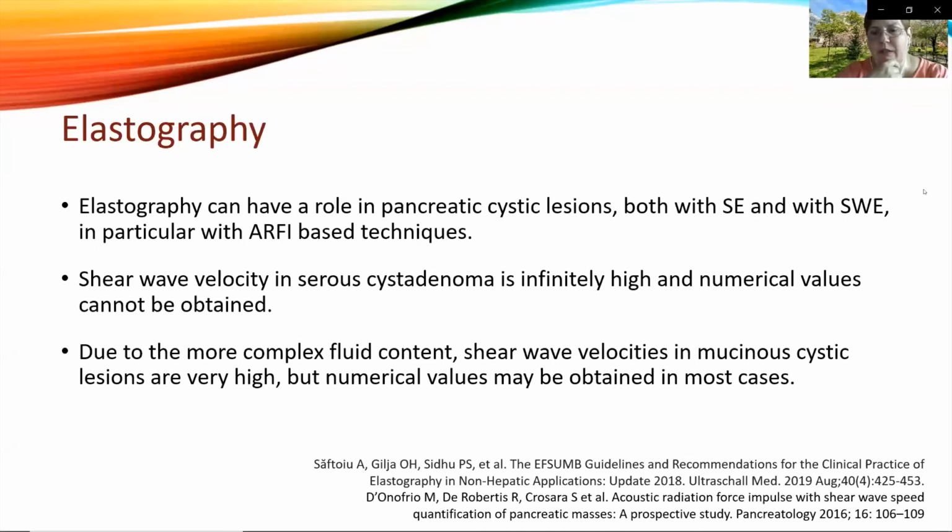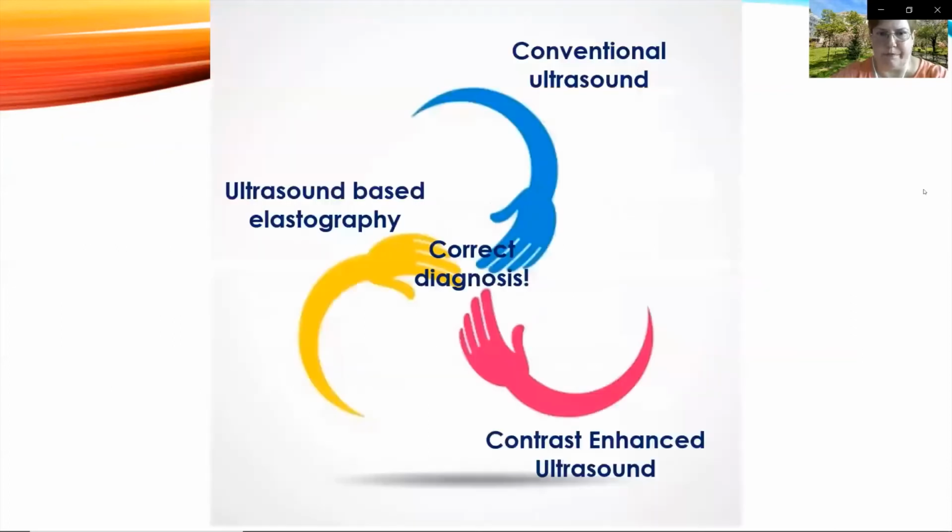But again, this technique is at the beginning of its use for the characterization of these lesions, and it can give you some additional information. But again, we need more studies when we are talking about elastography in such a lesion.